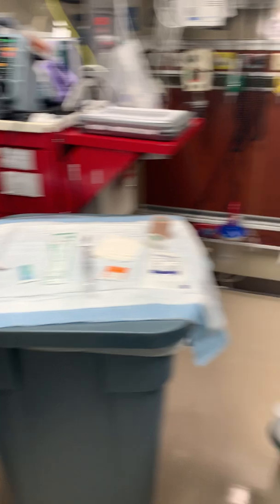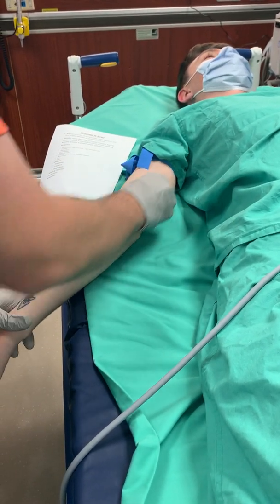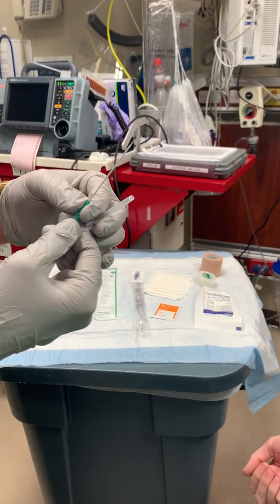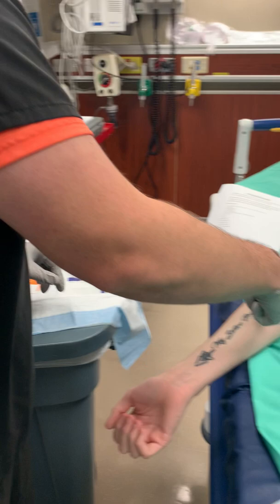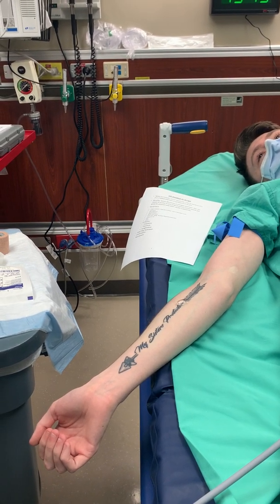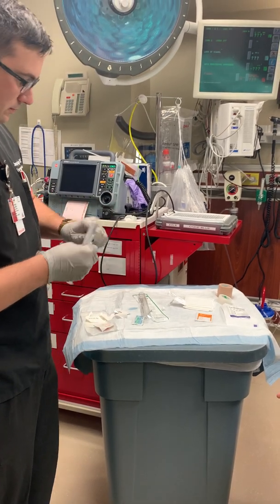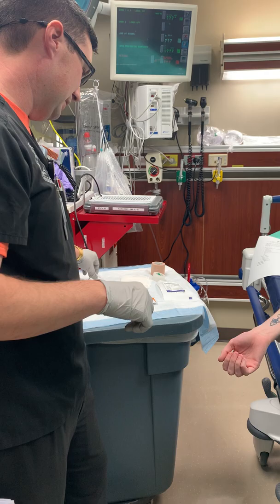Next I'm going to clean. There are two spots I like to look: number one is mid forearm, and number two is the proximal upper arm — that's where I look for my IVs. You can also clean the AC as well, so now I've got multiple spots to look with the ultrasound without having to re-clean. Next, I get my needle to make sure the bevel is functional and ready to go, and I like to place that needle just on top of the patient. I've got sterile lube — I put a little bit on the forearm to start and save the rest in case I need it. Then I take my saline lock. With ultrasound-guided IVs, I like to aspirate some blood into the syringe to verify I'm in the right spot, so I push a little fluid out first to give myself space to pull back on the syringe once I'm in.